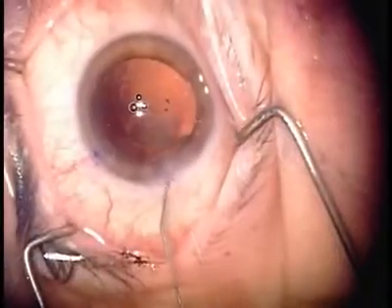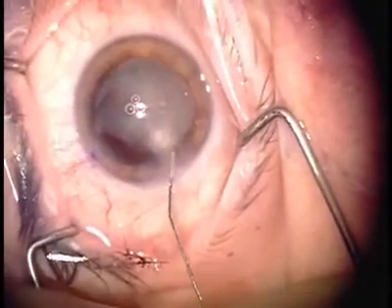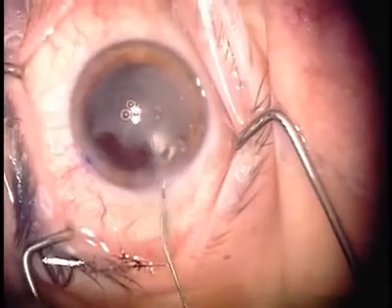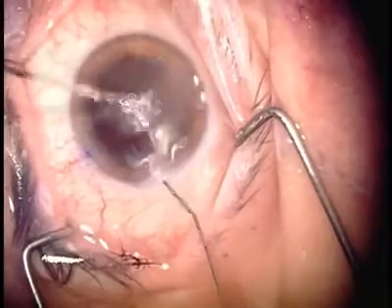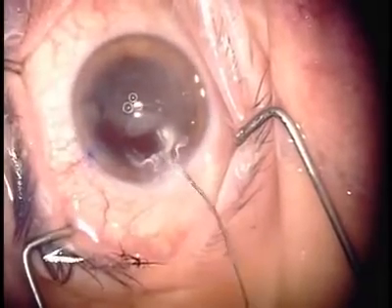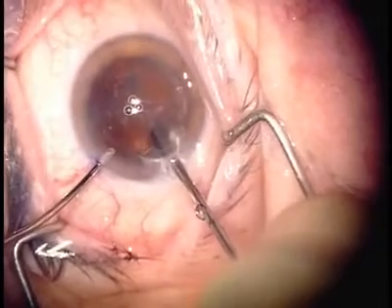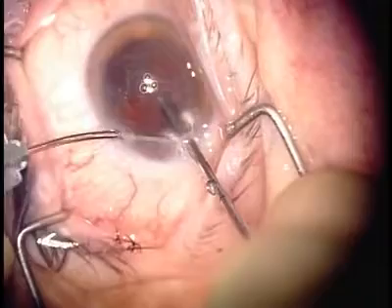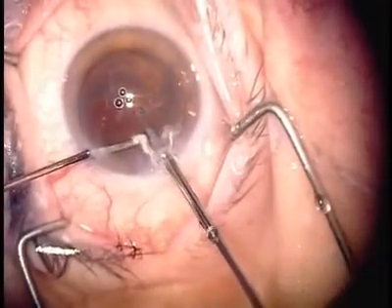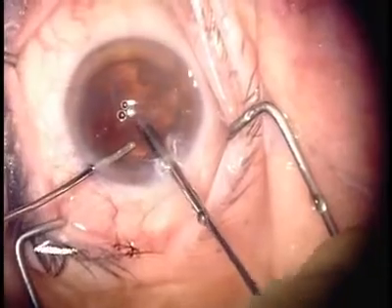We can see this now as we stain with the Kenalog, how eventually we did encourage the vitreous to come right up to the wound, which is exactly what we didn't want to happen. The Kenalog stain nicely clothes the vitreous and shows the outermost aspects of the vitreous. And here we're using the anterior vitrectomy instrument, and we have a tough time because we are trying to get underneath the cutter to do this.